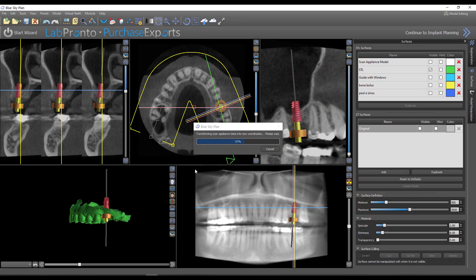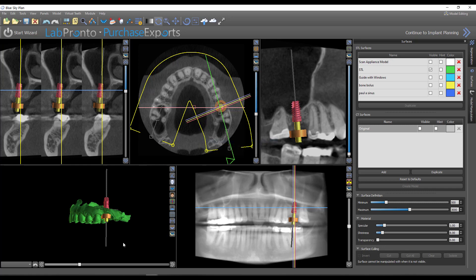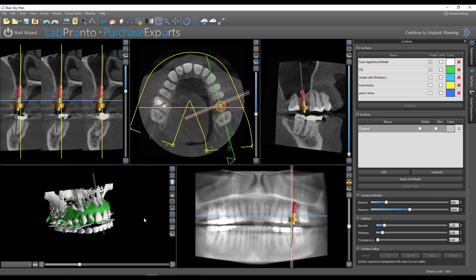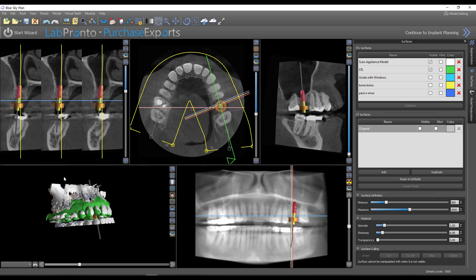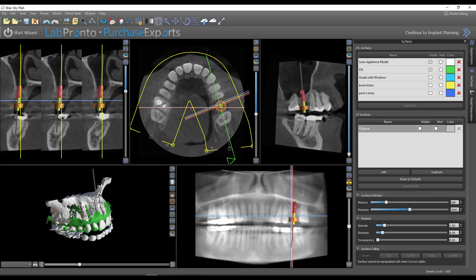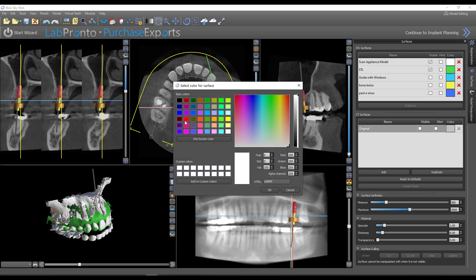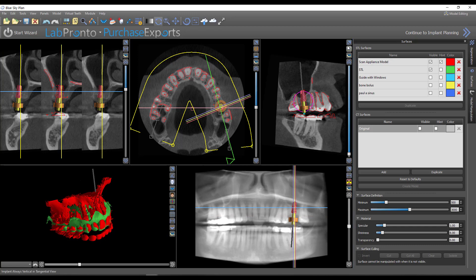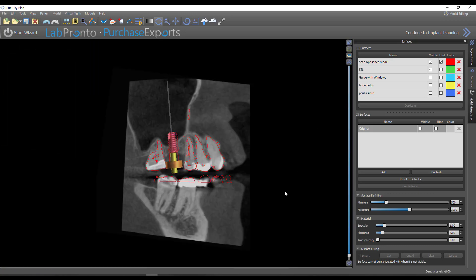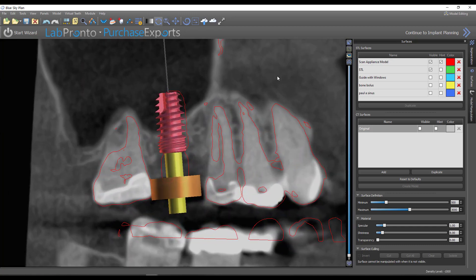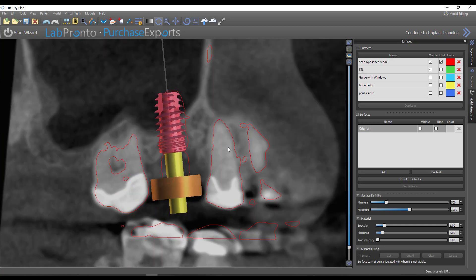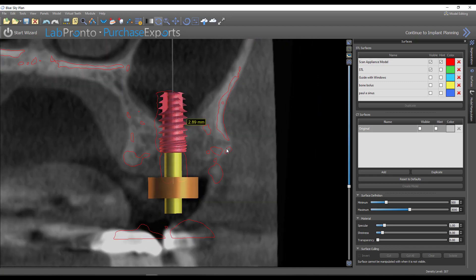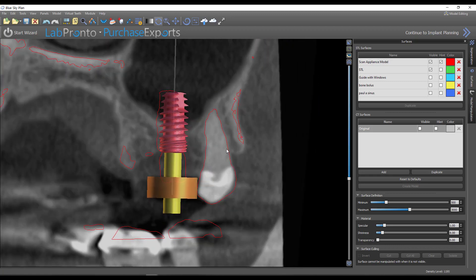Software is going to turn that into an STL now and bring it into the case. So now you see that this is called a scan appliance. You can see that it's stitched in place. And I'm going to change this to that red color that we were just seeing just because it shows up pretty distinctly. And now what I can do is turn on next to this, the hint. So the hint is just this model outline of that STL. And now if I was to center myself on the virtual implant, we can now compare the actual position to the planned position.